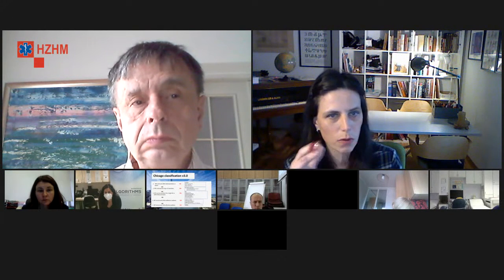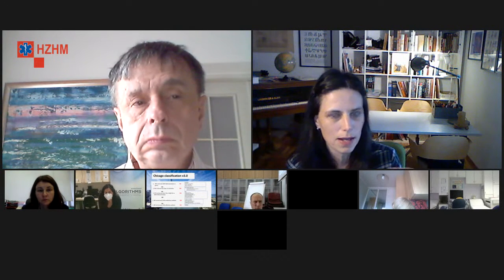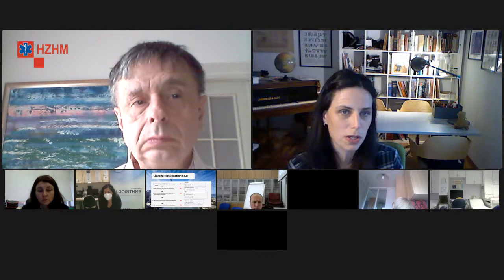I tu se uvijek dvojimo, znači imamo kompletno uredan nalaz, ali nam se doima da peristaltička rezerva nije baš očuvana. Ja se tu vodim isto svojim kliničkim pristupom, odnosno njuhom, pa uzmem u obzir kompletnu anamnezu i ne želim proglasiti pacijenta patologijom ako mi je sve do tada bilo uredno. Kako vi zapravo prema tome postavite? Ista stvar, procjenjujem od bolesnika do bolesnika. Da, od bolesnika do bolesnika procjenjujem tu peristaltičku rezervu.